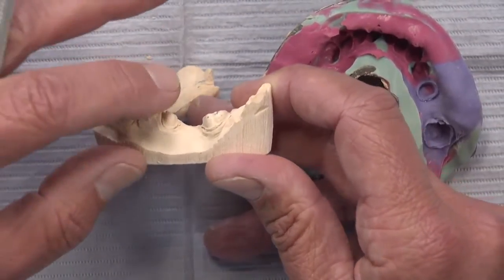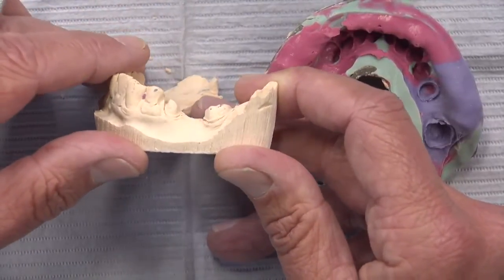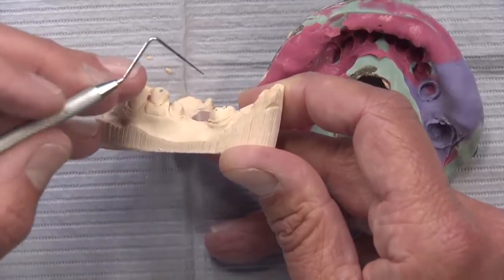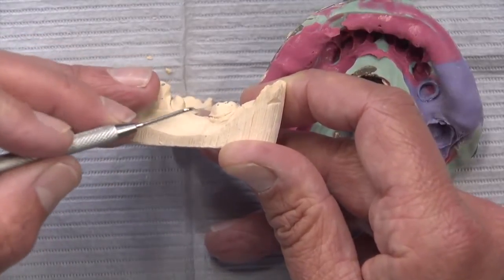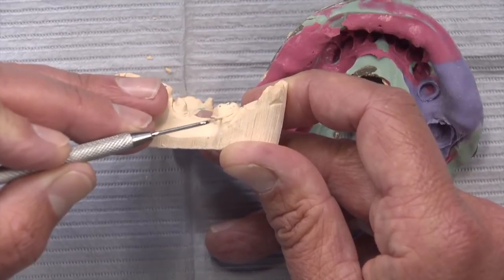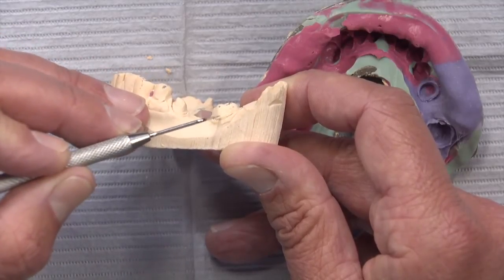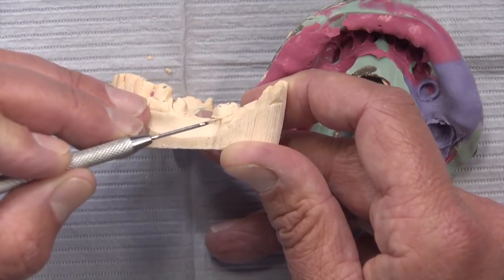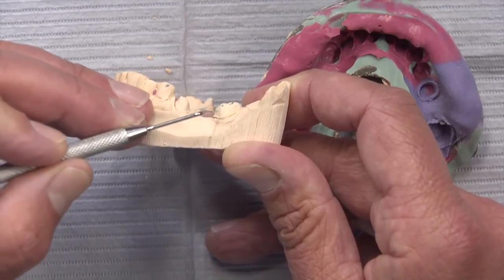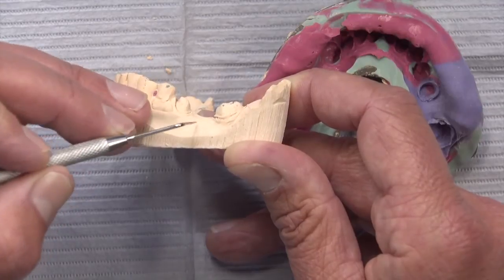Diode laser, very easy to go in and trough the tissue around a posterior tooth. I don't like doing it on anterior teeth because anytime I use a diode laser, and it just has to do with the width of the tip, I always lose a little vertical height on the tissue, and I don't want to expose a margin like this on an anterior tooth. Back here on a molar, not a big deal. On a central incisor, to expose a margin like this, that is going to be a big deal. Aesthetically, we don't want the patient to be able to see where the tooth and the crown come together.